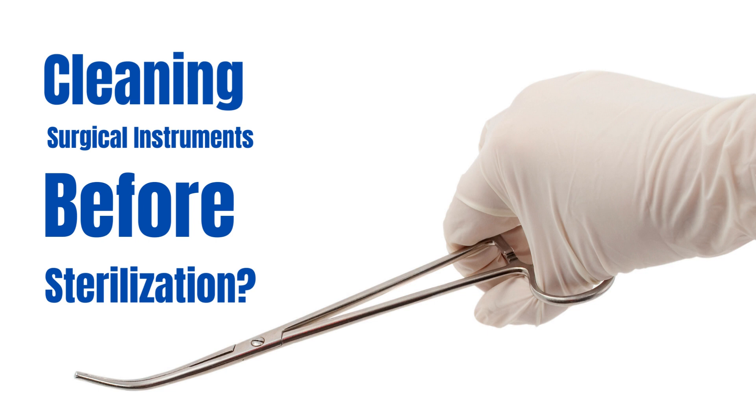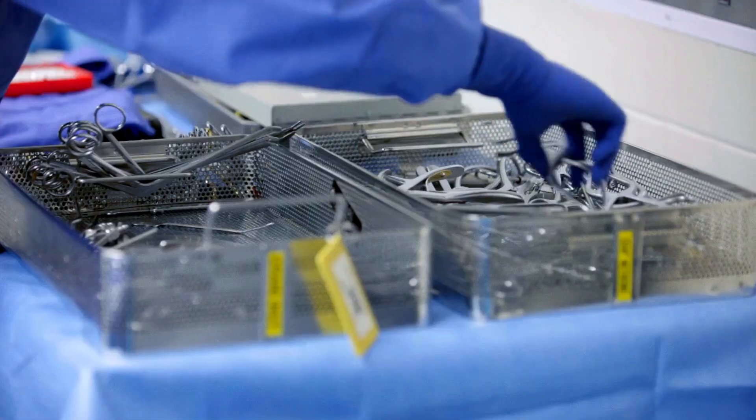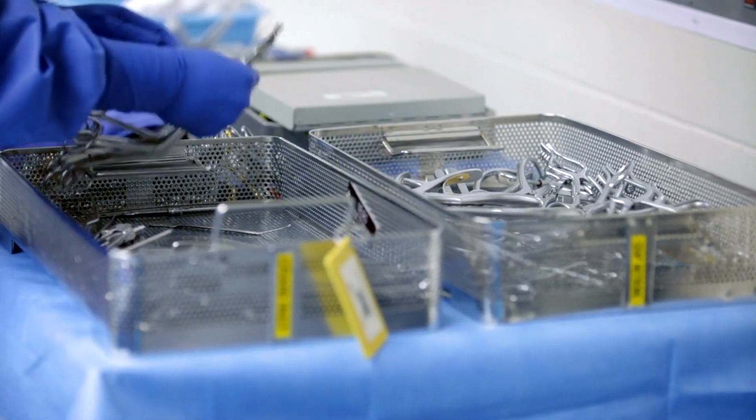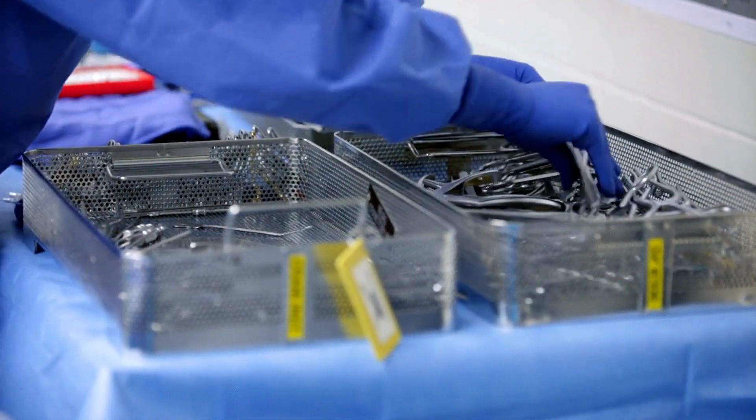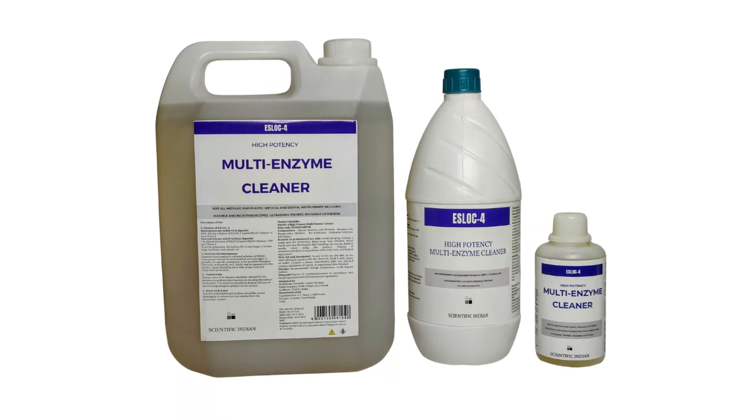In the fast-paced world of surgeries, precision is paramount. But did you know there's a vital step before sterilization that can make all the difference? Introducing the secret weapon every surgeon should know about: multi-enzyme cleaners.